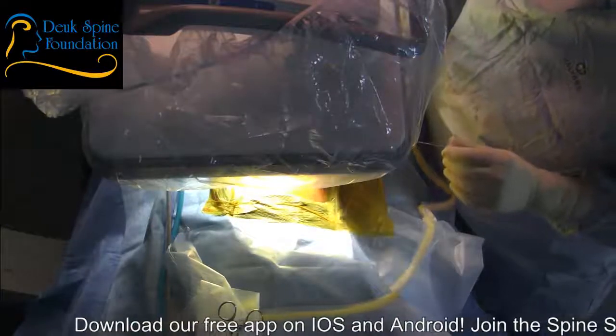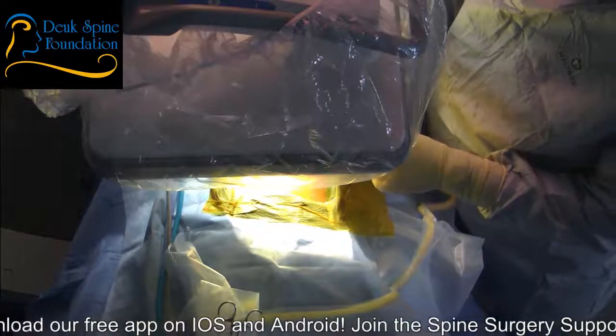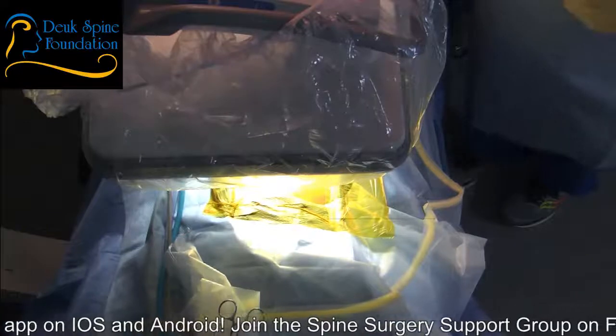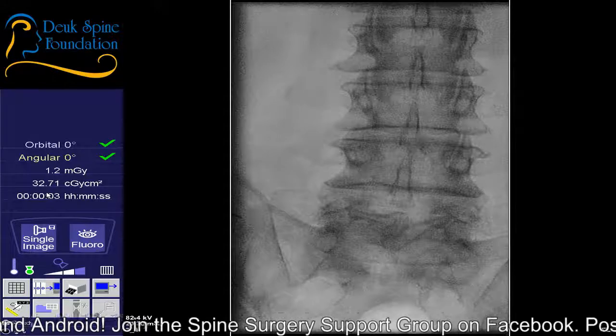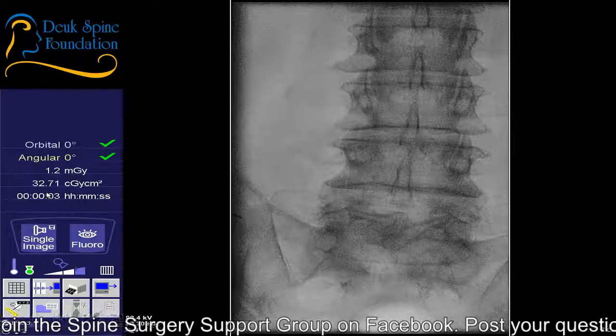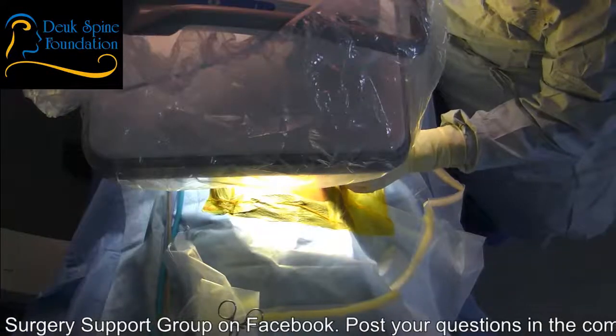This is the way most people hear about it or think about it. We're treating them both with a surgery designed to fix both. Shot. And the reality is that most people that have problems with herniated discs, they either have back pain, leg pain, or both. In his case, he's got both. Shot.